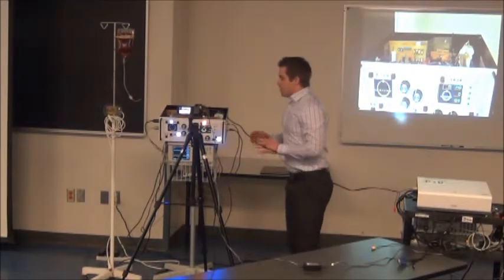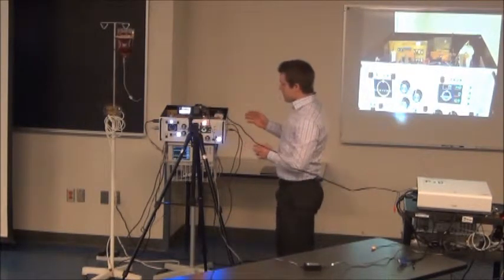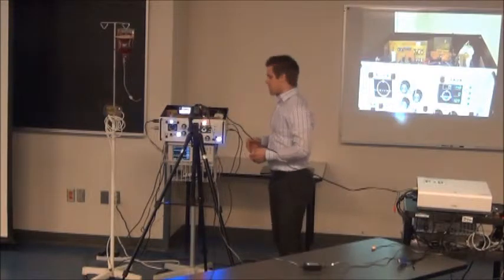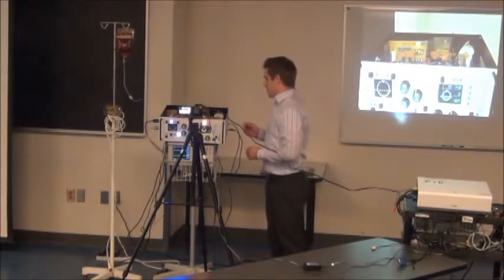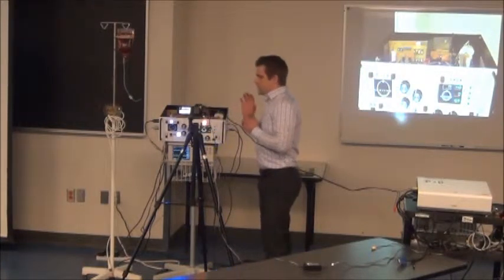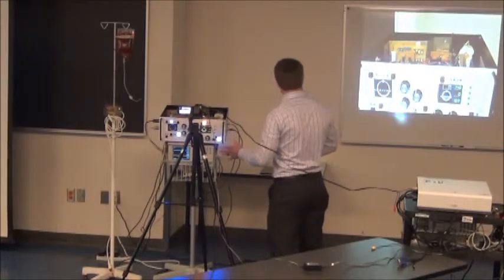Okay. A few simple quality upgrades that we did were the layout of the boards. We used a motherboard system, continued on from our last semester ECG project. We have our ECG on the left side, and our BP on this side.